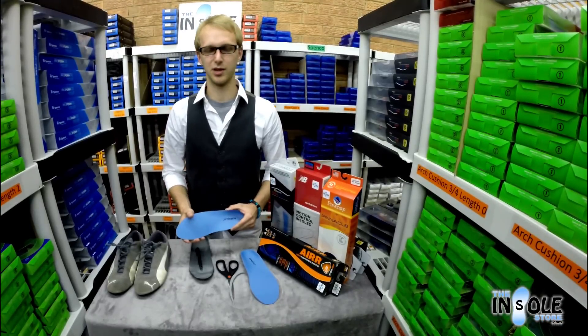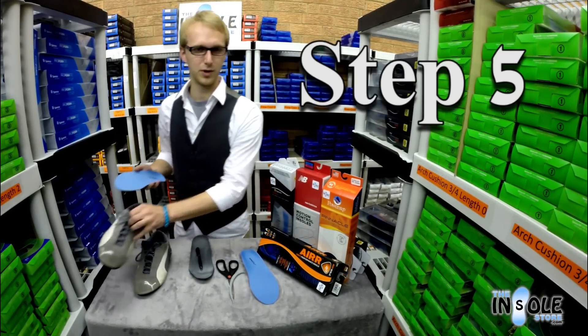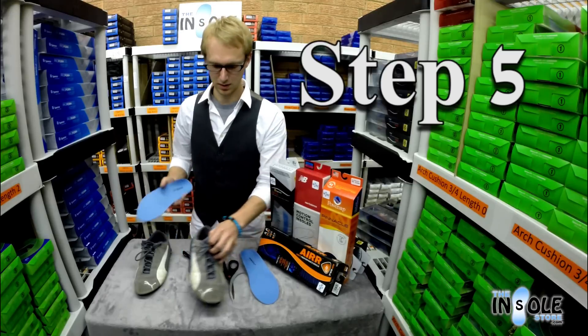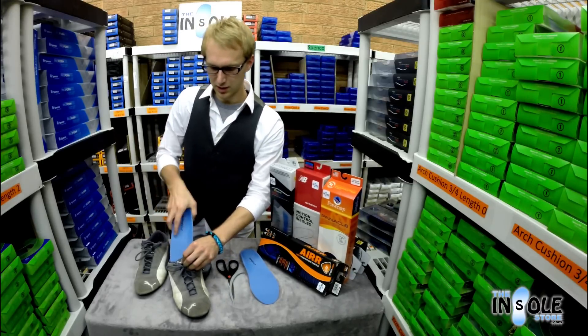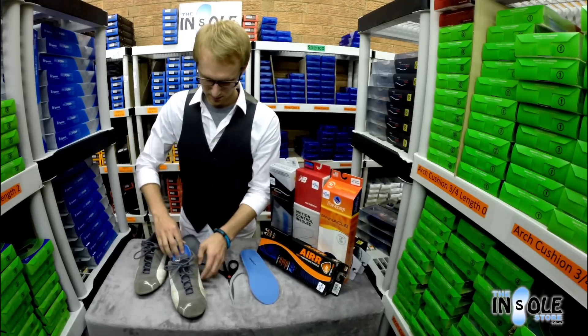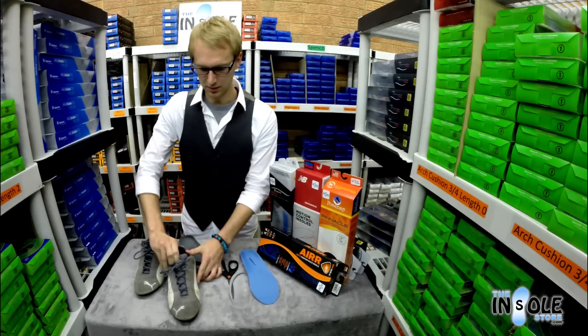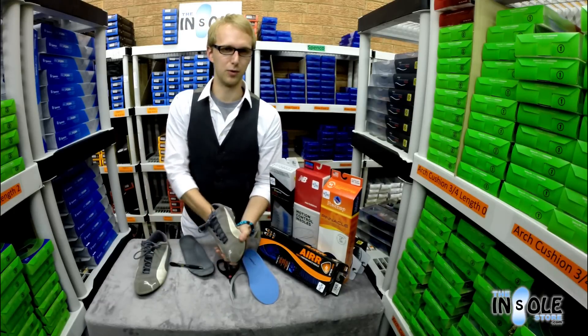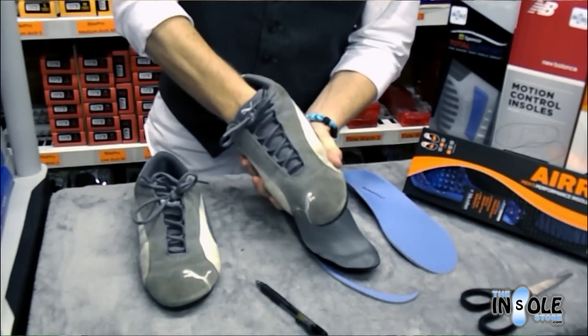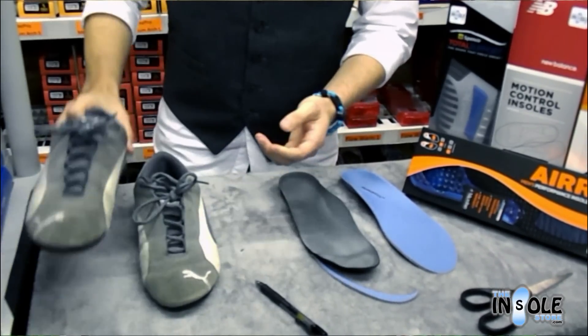Now that you've trimmed the insole it's time to place it into the shoe. Supporting the forefoot of the insole, gently work the insole into your footwear. Then push the heel into the shoe and make sure the forefoot did not buckle. Your insole should have just a little bit of wiggle room.